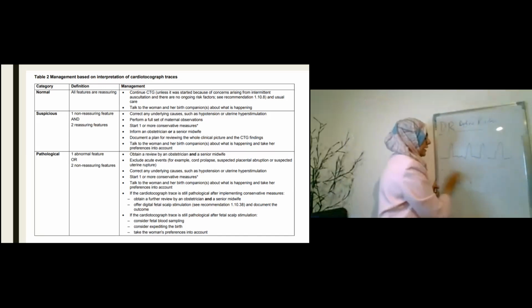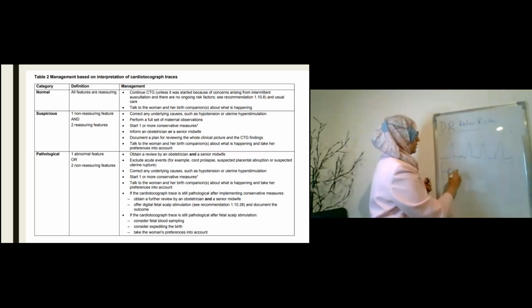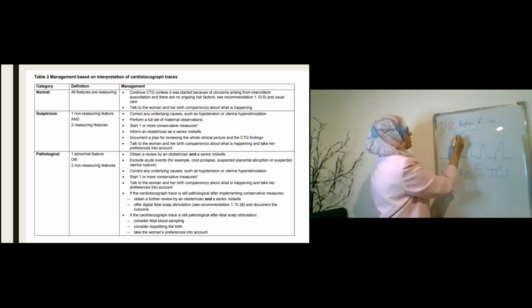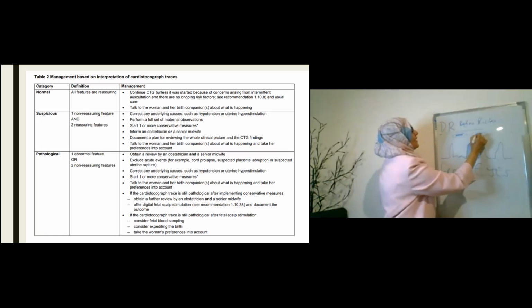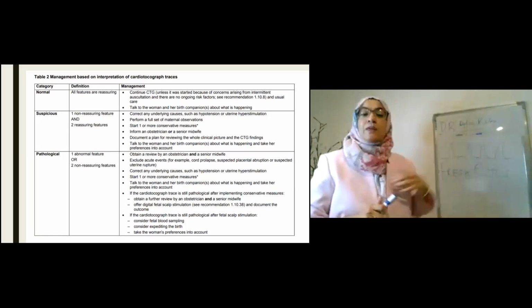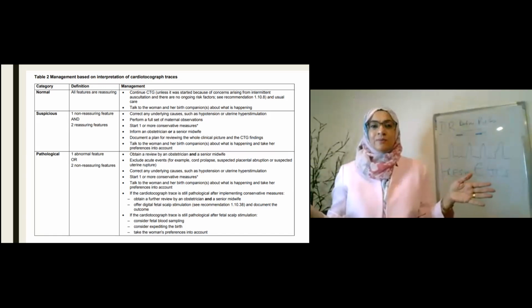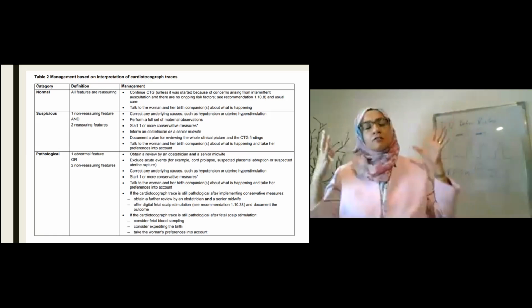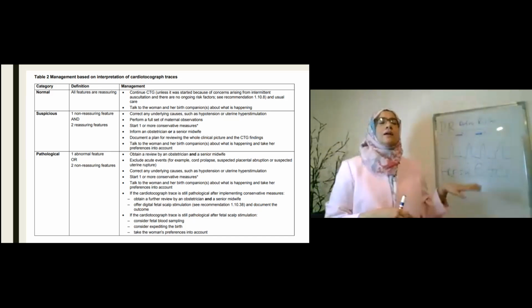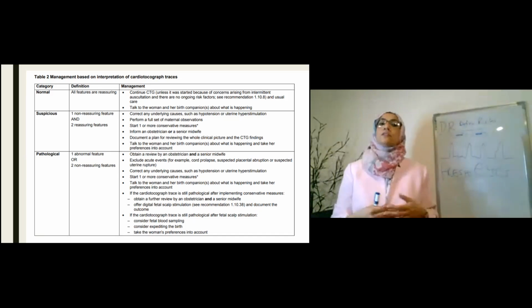So to avoid that, we have come up, as obstetricians and midwives, with an amazing phenomenon, and we call it fresh eyes. I know it looks creepy, but we have little stickers on our CTGs with these fresh eyes, which means that you have the same midwife looking after the patient for 10 hours and she's not delivering. Remember the graph? She's not getting from A to B. She's still 3 centimeters. You're pushing an oxytocin drip to get her there. And she's watching the CTG and she says, oh, it's fine. But we have this phenomenon now in our labor ward which is called fresh eyes.